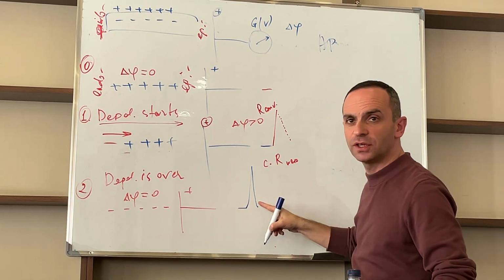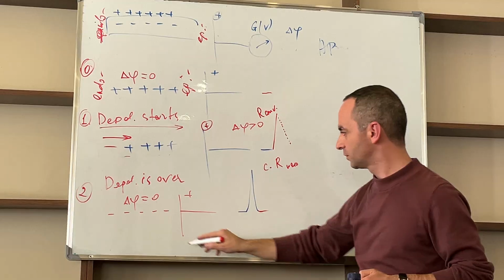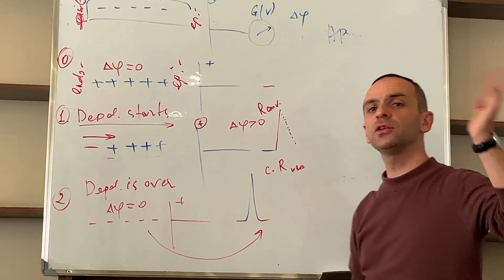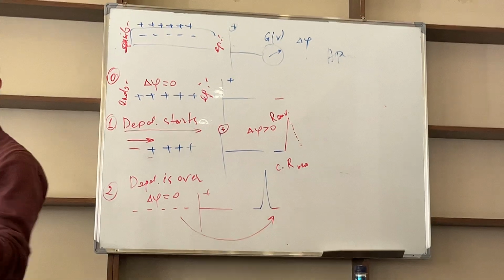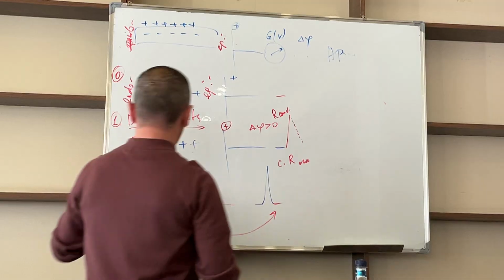Yes, this R wave we had. Now we'll have the second isoelectric line, because there is no difference of potentials. It will correspond to the ST segment, which usually is on the baseline. So it is showing the condition of the myocardium when depolarization is over and repolarization has not started yet. Was that clear?